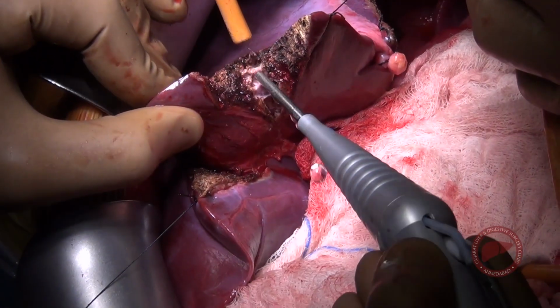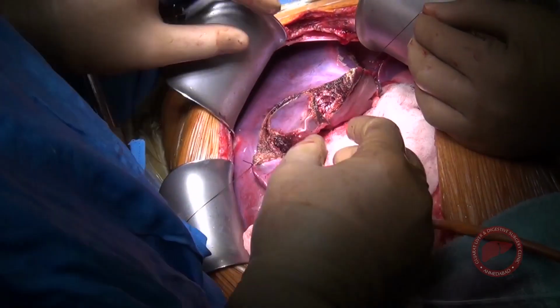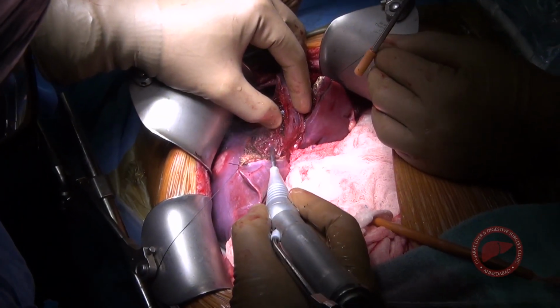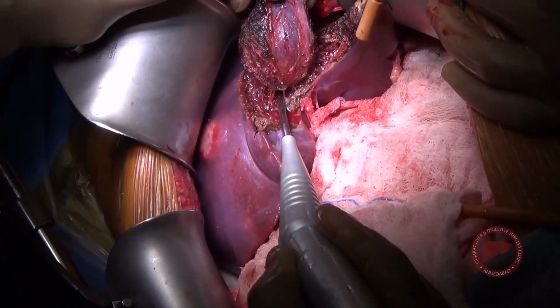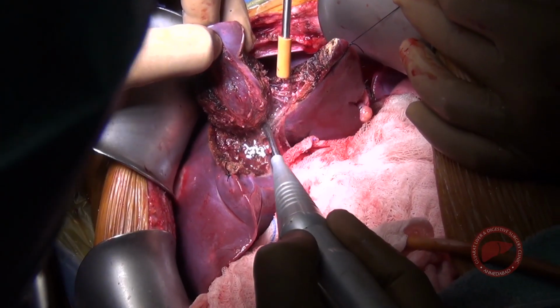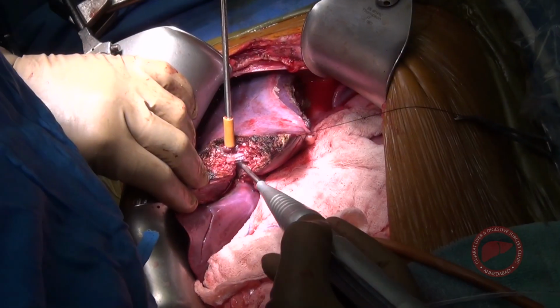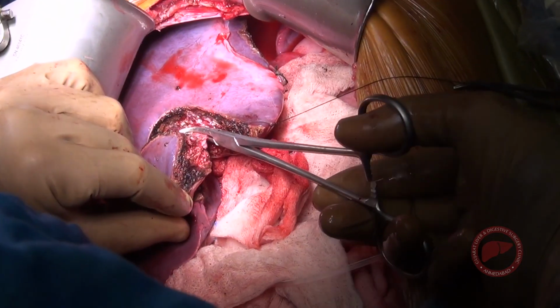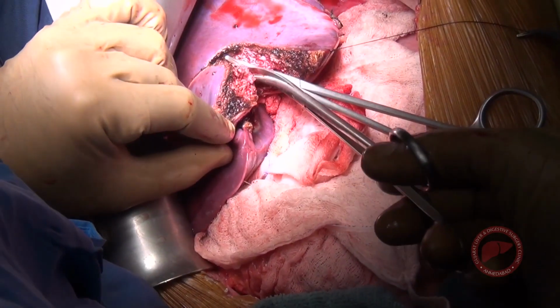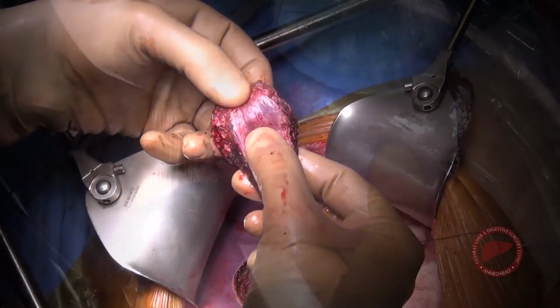You can see the dissection was done from both sides with a clear margin. A pedicle was clamped and it was divided and the metastasectomy was completed. So that's a metastasis with a clear margin.